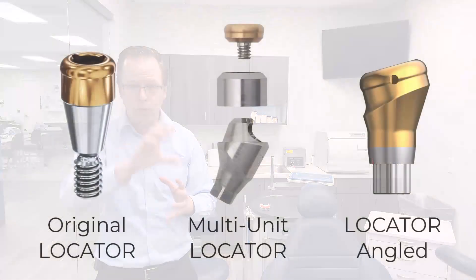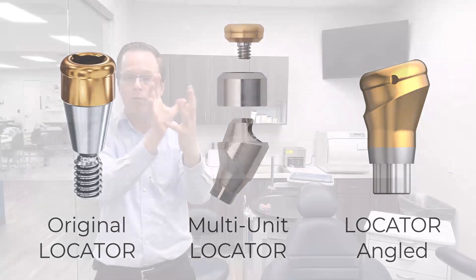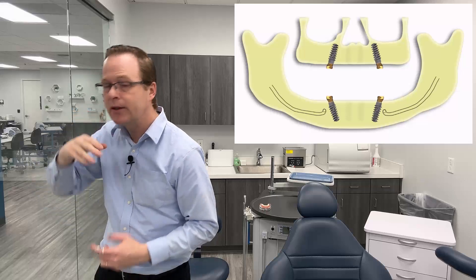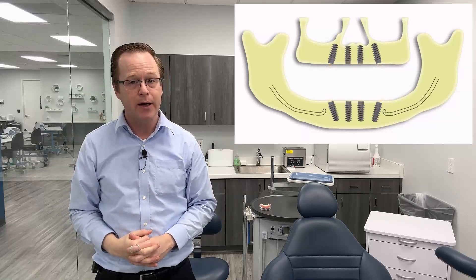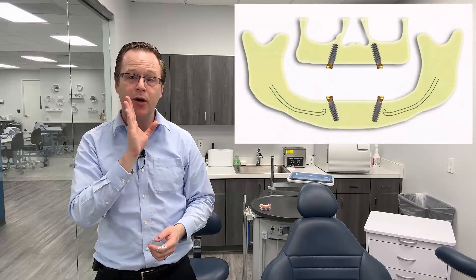Where the original locator goes in one way and the multi-unit abutment goes in one way — the angle of the multi-unit is how we change the position — with the new locator angled, it comes in multiple different positions where we can rotate that angled abutment on the implant to correct for distal tilting or anterior tilting like in the pre-maxilla area. That distal tilting is really effective for avoiding critical anatomy such as the mandibular nerve or even sinus structures on the maxillary arch.